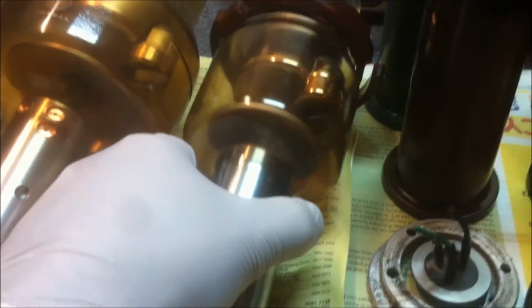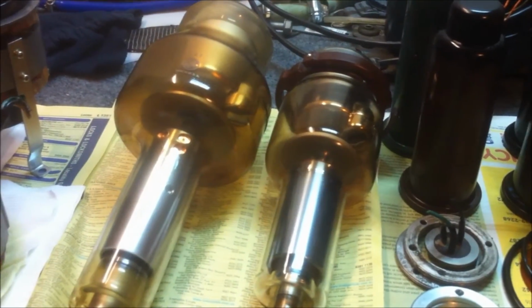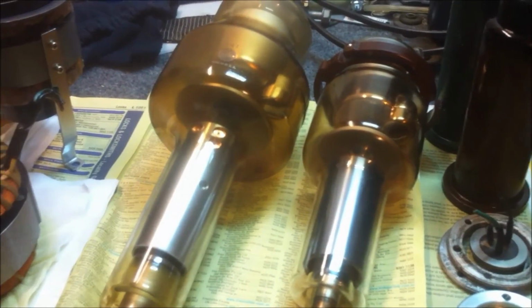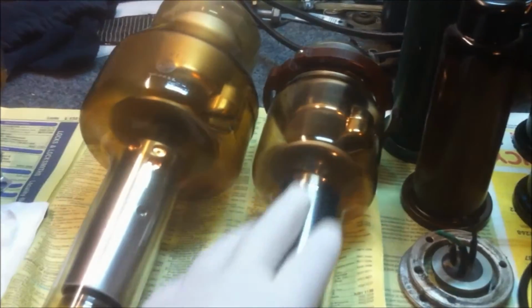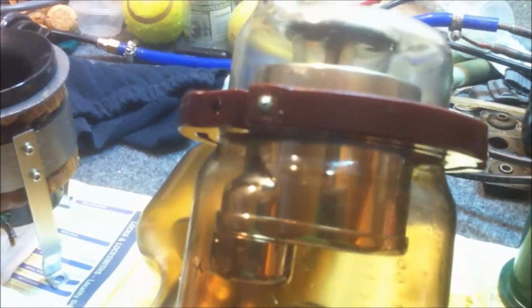chamber. But I'm a bit cautious in doing that because I know some of these X-ray tubes and magnetron tubes contain things like beryllium oxides and coatings and mercury and all sorts of stuff. So if anyone knows if there's anything sinister inside these tubes, can you let me know? Because if there isn't, I'll probably do a video of me taking apart one of these X-ray tubes here, which would be this one here, to salvage this main anode assembly here. And we might even keep some parts out of this cathode up here. But yeah, that would be good to know if anyone knows if that's safe or not.